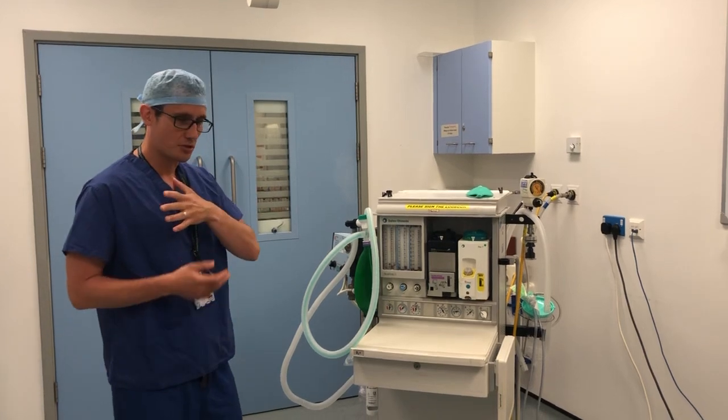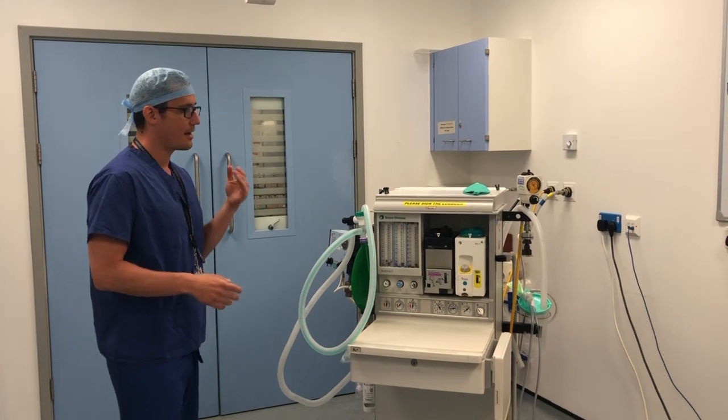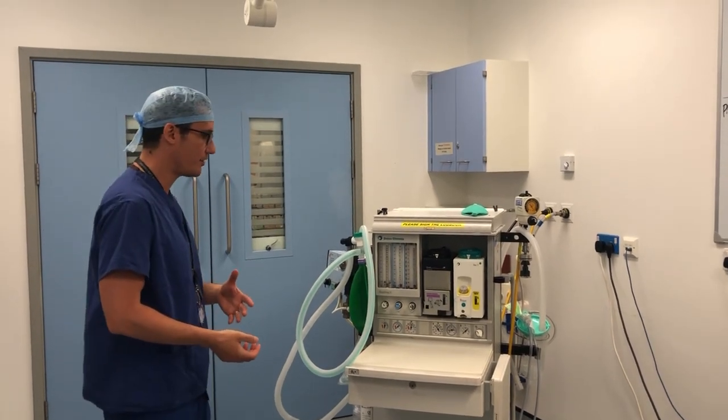The first thing we're going to do is go through the machine check without stopping — just going through the different elements. Then we'll stop, and I'll do a second version where I actually talk through each and every step, what I'm looking for, and what I'm going to consider as a pass or a fail.